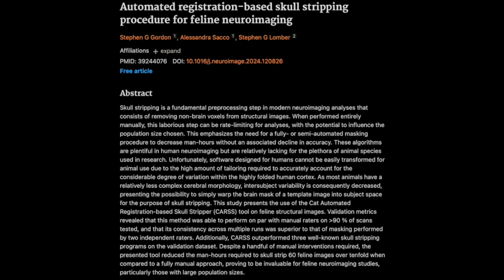So it was a real head-to-head, or should I say brain-to-brain, competition to see which tool reigned supreme. Exactly. They ran each of these tools on that same set of 60 scans, comparing their performance to the gold standard manual segmentations using the same rigorous metrics: Dice similarity coefficient and Hausdorff distance.